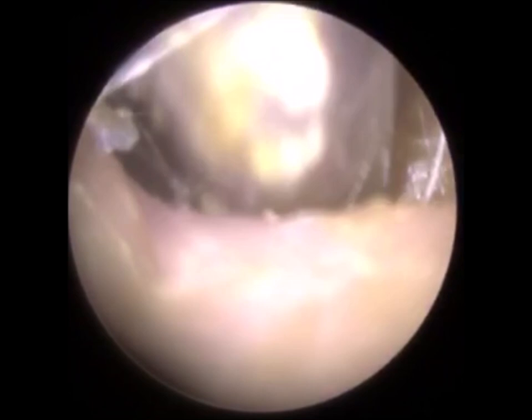The consistency of that dead plug's skin, it's wet, it's damp, it's just tearing off into little pieces. You can see how damp it is there. It's just fogged up the screen a bit, so you can see all that moisture. So again, I'm just trying to loosen it with the vacuum, with the suction. Just trying to bring it a bit forwards, and as I do, I will then alternate between the range of ENT micro instruments.